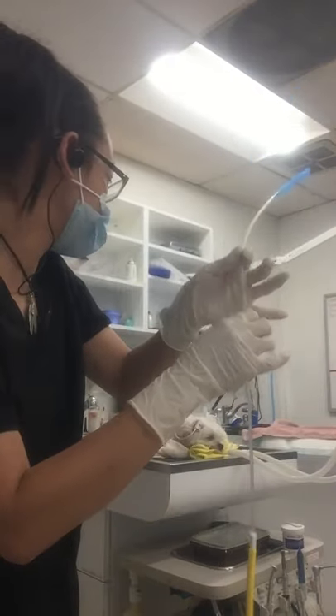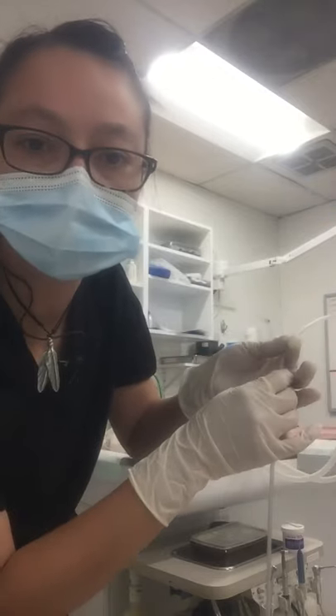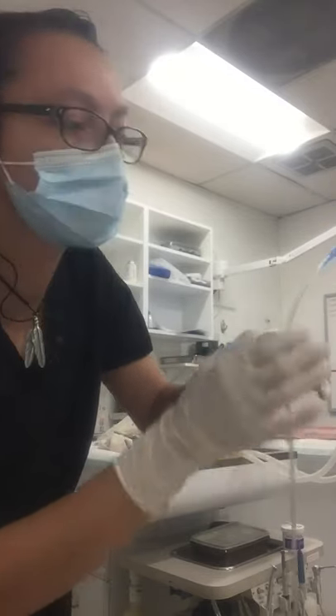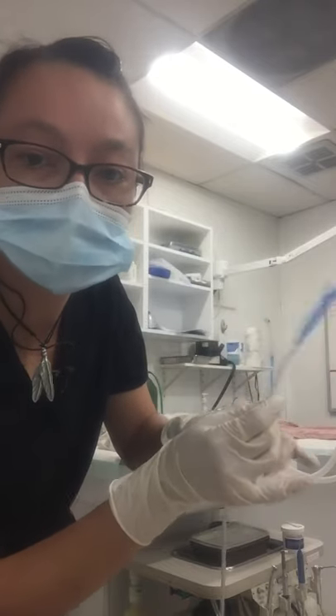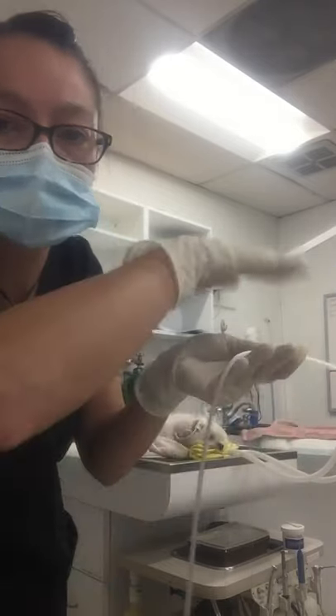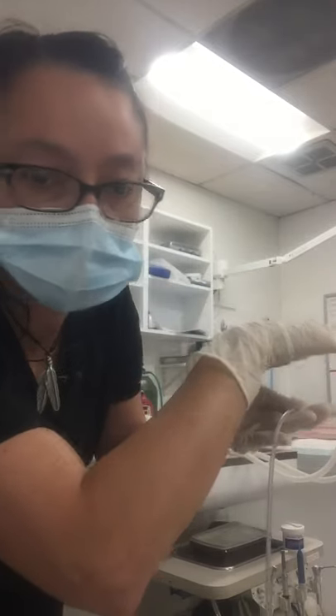First I'm going to open the mouth and lower the tongue. Because the trachea tube is in place, there is no way I'll be able to get this into the trachea, so this is actually going to go over into the esophagus. The esophagus sits just on top of the trachea, and the stomach actually gears towards the left direction.